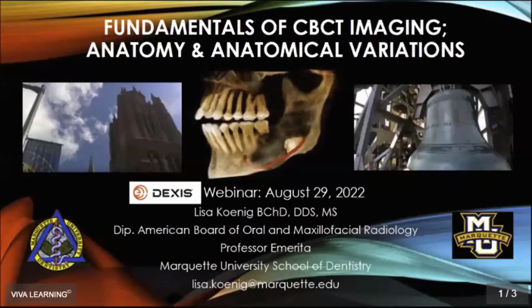But you're going to get higher radiation dose if you do a smaller field of view and a high resolution. You just have to have more juice in order to get the information that you need. So it's really hard to say what's the comparison between just generalized CBCT, because it will very much depend on the field of view and the voxel size.